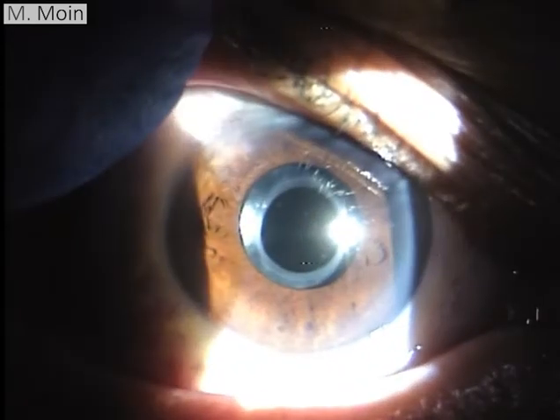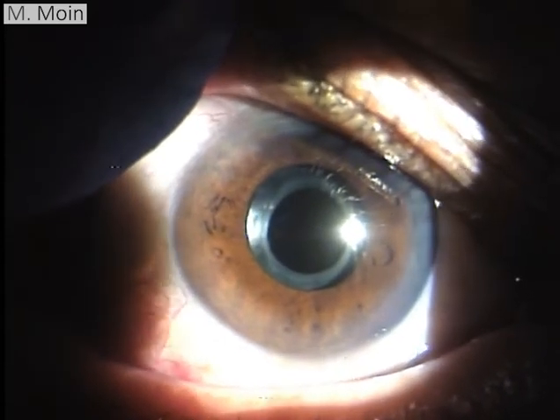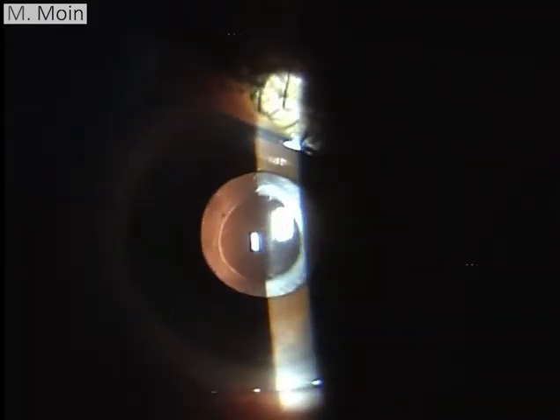This is a patient who had a pars plana vitrectomy and then silicone oil placed, which was later removed. It is seen in patients who have had silicone oil in the eye for a few months that they develop anterior capsular phimosis and posterior capsular thickening. Here you can see a mid-dilated pupil, the IOL is in the bag with a mild degree of anterior phimosis, and you can see the shining of the lens from both the anterior and posterior surfaces.